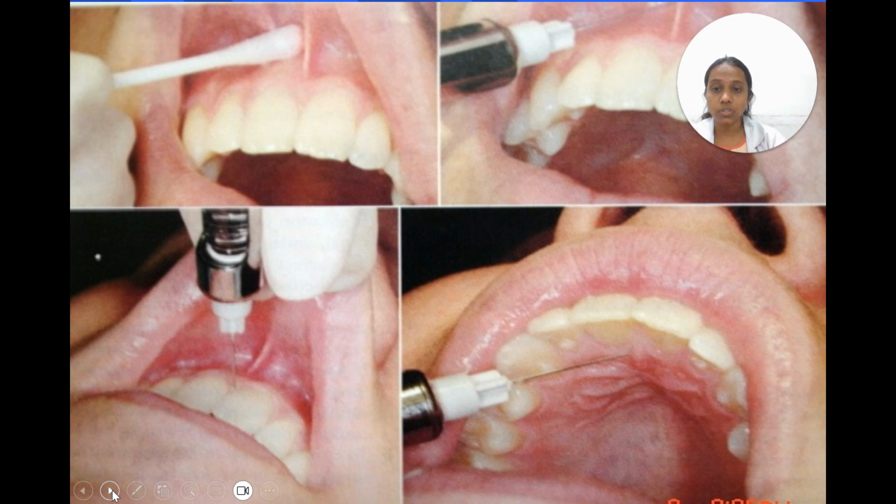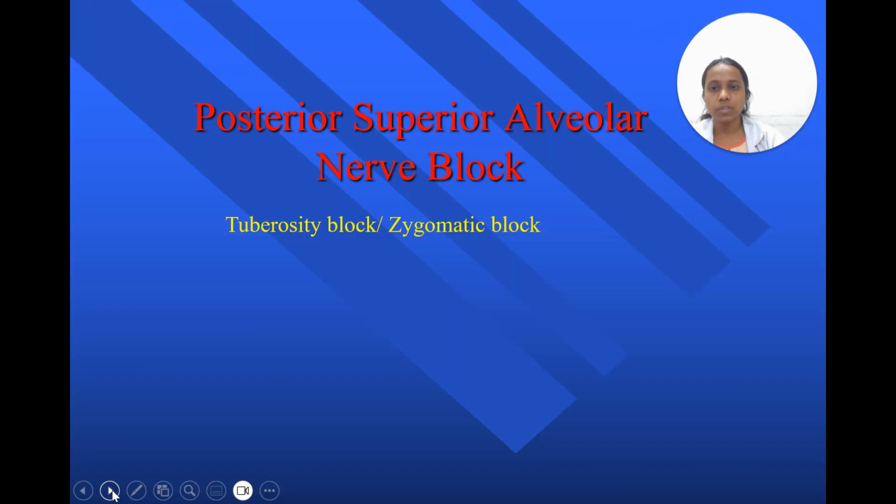This multiple injection technique is preferred in patients who are more apprehensive or less tolerant to pain or needles, who are scared of the needle stick pain. After the preparatory injection, you again go onto the palate and identify the incisive papilla. From the lateral aspect of the papilla, you enter the nasopalatine fossa or canal and then give the injection.